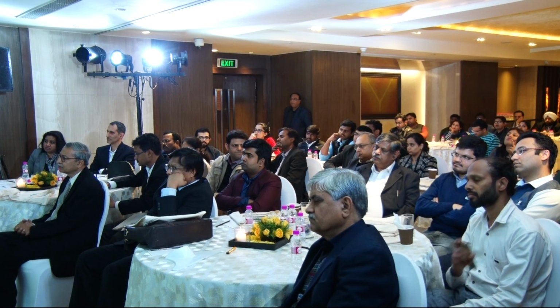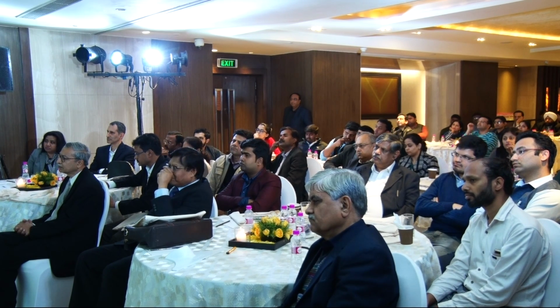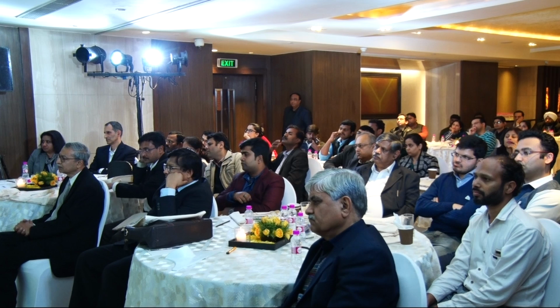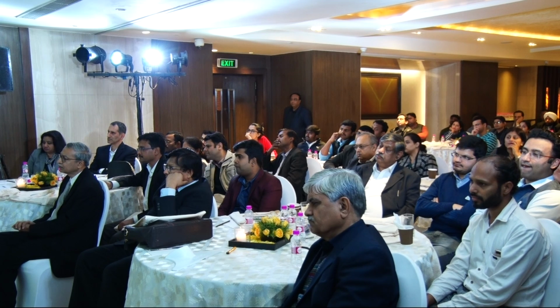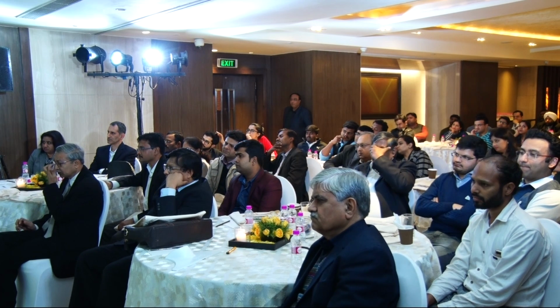We can see that in those last two couch angles, if you look to the right there on slide number 14, the next slide, the patient's ROI, which is essentially the face for an SRS patient, is essentially walking off the field of view. You have a round optical lens projecting onto a rectangular sensor, so you have some truncating of the information at the edge of the sensor, and so that contributes to a little bit of an inaccuracy around the 0.7 of a millimeter range at this point, because you're operating right at the extreme edge of the field of view of the system.